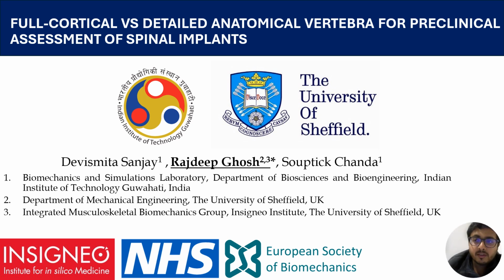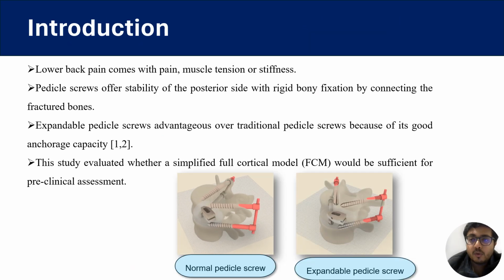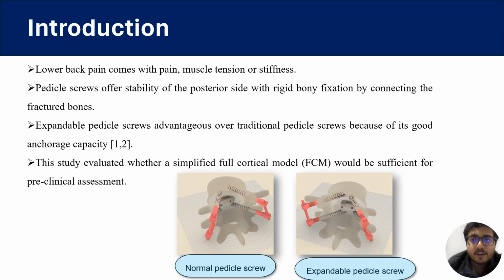Hello everybody. This talk is about an understanding between the use of full cortical versus detailed anatomical vertebral models for preclinical assessment of spinal implants. Lower back pain comes with pain, muscle tension or stiffness.